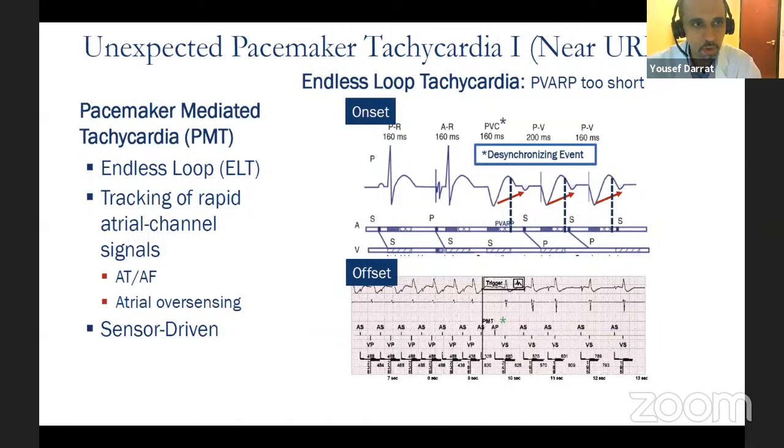Mohammed, do you have any comments about this? No, I agree with Khalid, but the problem becomes, and I gave up on these arguments with imagers and MRI a long time ago. At the end of the day, they will tell you that the patient in the scanner is under my liability. And for them as radiologists, an abandoned lead is contraindicated to do an MRI.